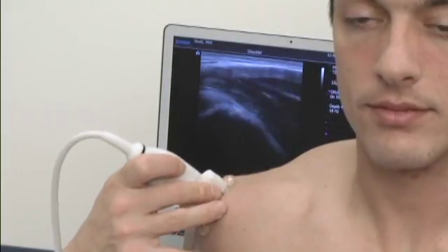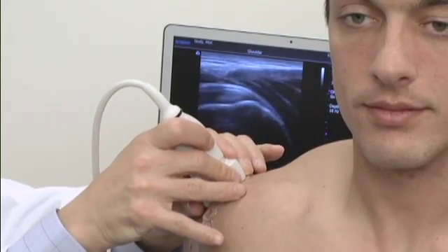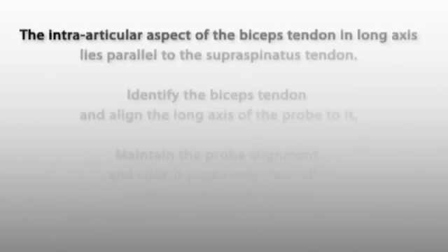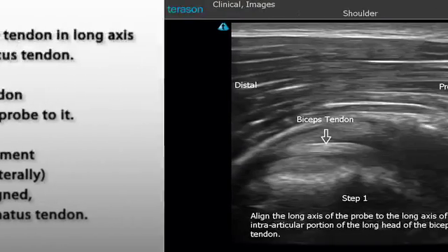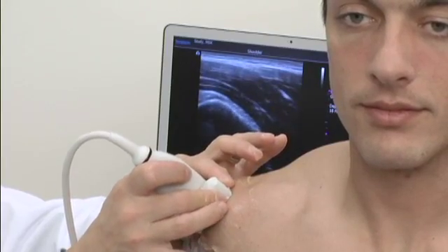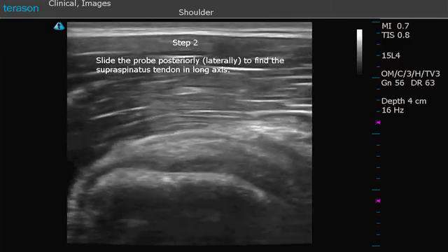Next, we'll go back to what is known as the bird's beak image of the supraspinatus tendon. I'll make sure I'm going to go forward again until I pick up that biceps tendon. I know that I'm in line with it, so as soon as I pull back a little more posteriorly, I should be in perfect alignment with the tendon. And there it is — that's a good alignment.